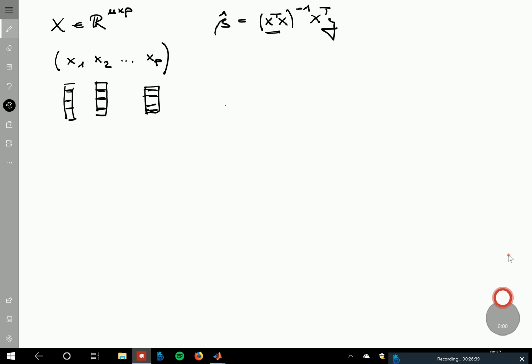So these are just the columns of the design matrix, and for example x1 is then just a vector with entries like this. So this is what I'm talking about right now. We have these vectors and they are n-dimensional vectors, so lists of n numbers. These are the regressors that we just generated based on convolution and subsampling to our microtime resolution. So remember these black sticks? These are the ones that I now talk about.